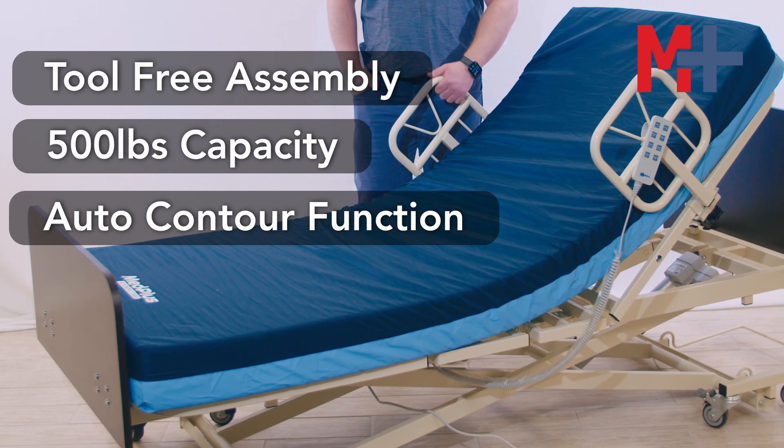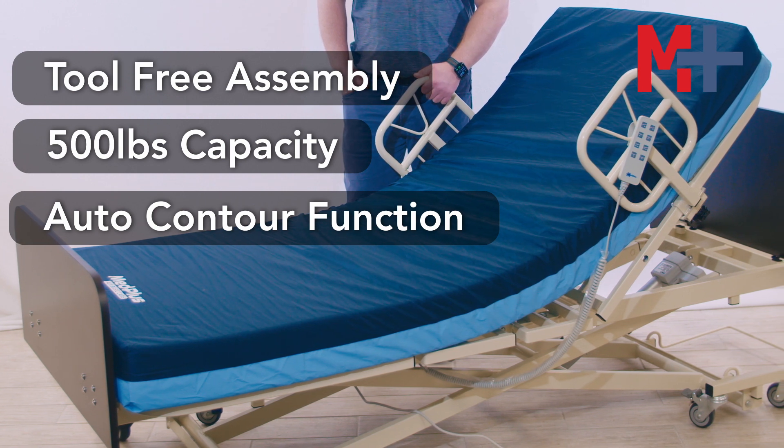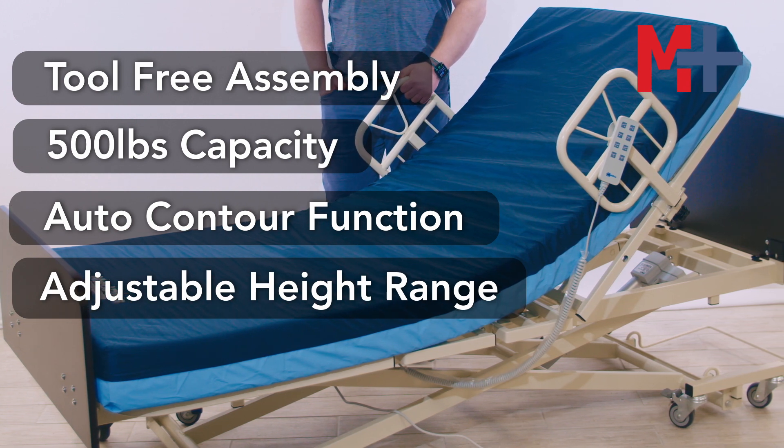along with better positioning for reading, TV watching, and caregiver interaction. The SafeCare Hi-Lo bed has a 7 to 30 inch height range in the 36 inch width, and a 9 to 30 inch height range in the 42 inch width.